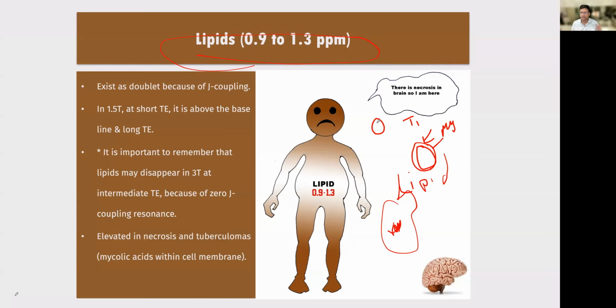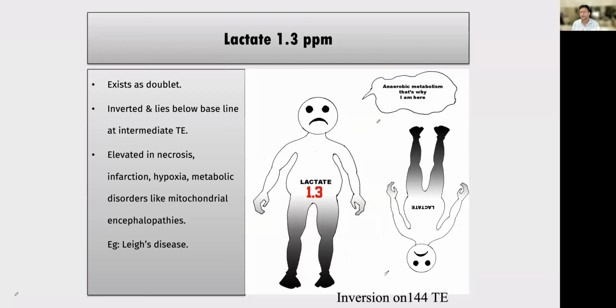So similarly, in the background of conventional imaging, you can add some more information and add an edge to your reporting, because understanding spectroscopy, perfusion, and also CSF flows, all these things are very difficult for a dedicated general radiologist, or even a non-dedicated general radiologist, or even a neurologist or a neurosurgeon. So this adds value to your reporting, which you should always inculcate.